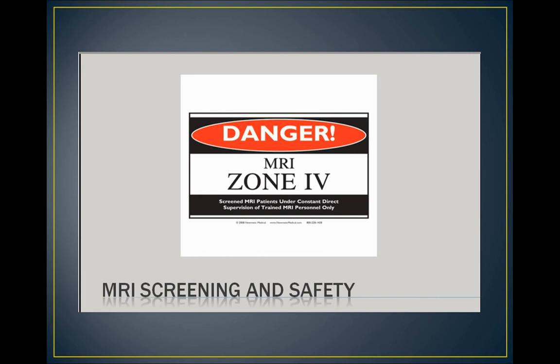MRI Screening and Safety is one of the most important aspects of MRI today. We have to be careful with regards to the strong magnetic field produced by today's superconducting magnets. There are many precautions that we have to take to keep ourselves and our patients safe in the MRI environment. It is up to everyone in the MRI department to be involved in the safety of our patients. This includes the schedulers, front desk staff, MRI technologists, tech aides, and radiologists.